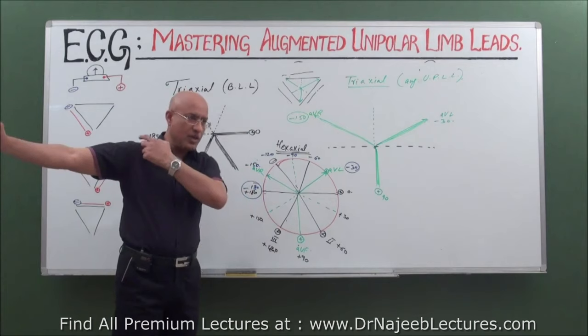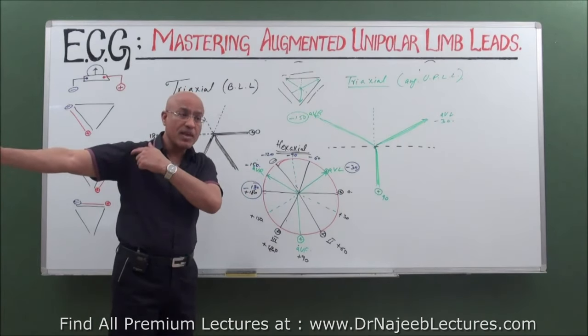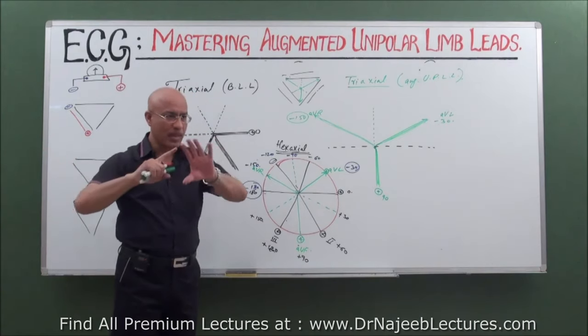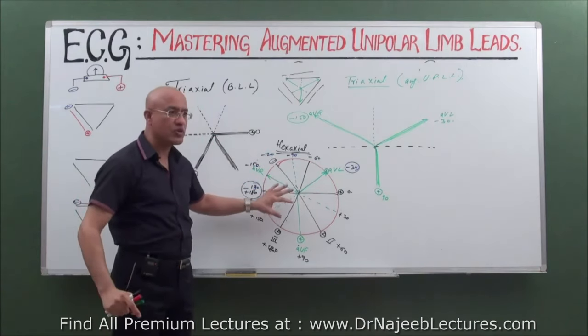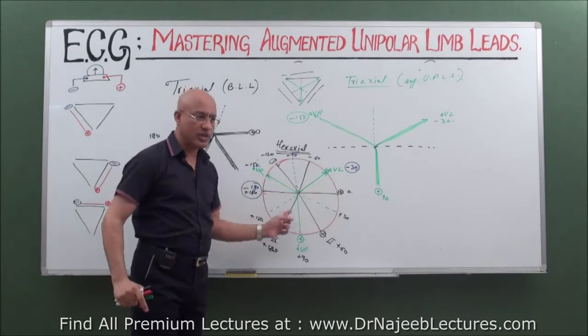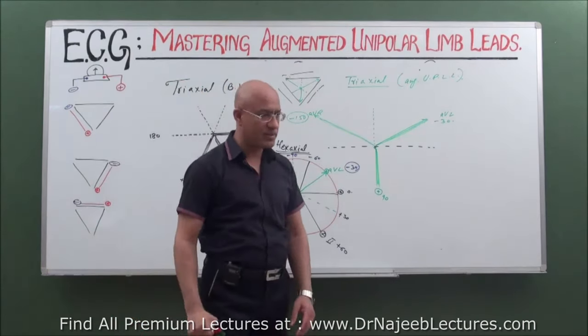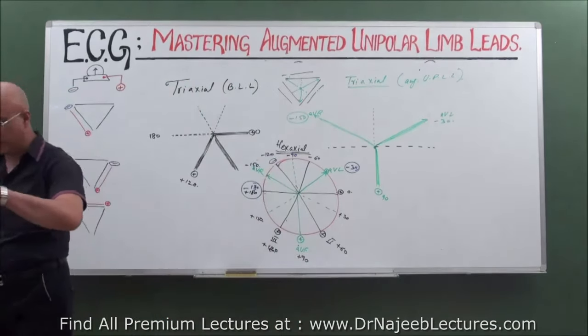Minus 150, positive polarity at left, right arm. Is it clear? Here you must know the orientation of the leads relative to each other and what their polarities are. Do you have any question up to this?